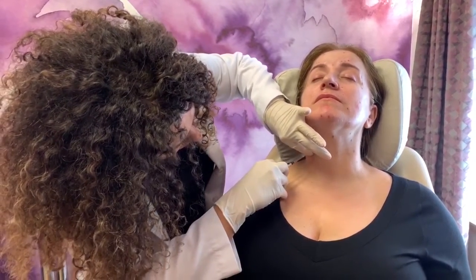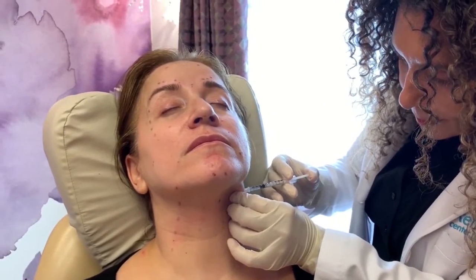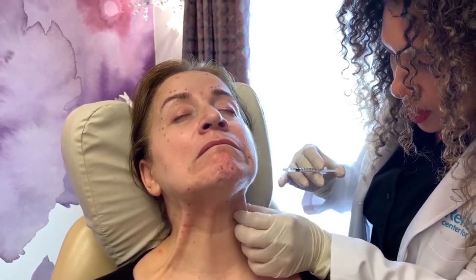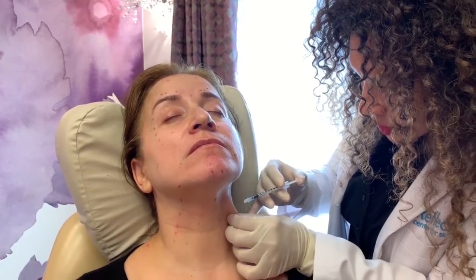Along her neck, we're using Botox to treat the platysmal bands and to rejuvenate the neck. I have her contract those muscles to ensure that I'm injecting in exactly the right place. The neck is not an area you want to have a novice injecting — you've got to be precise here.